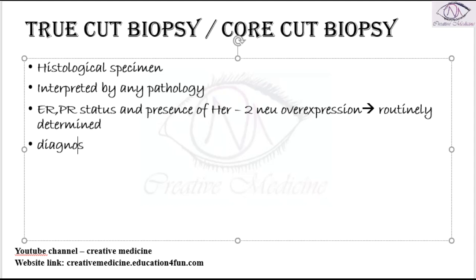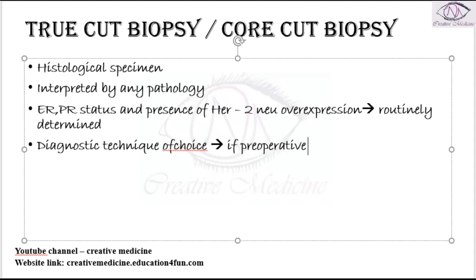Then we have the diagnostic technique of choice. This is the diagnostic technique of choice in many conditions, especially if we have to do preoperative systemic therapy. In order to give preoperative systemic therapy, we should do true cut or core cut biopsy.